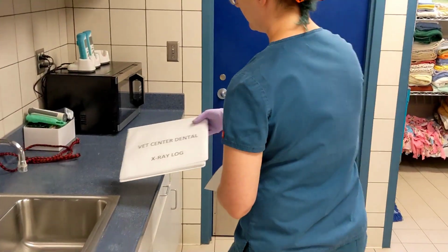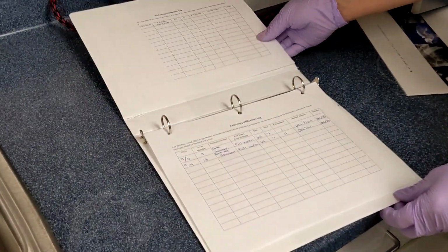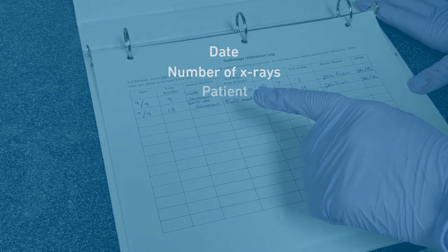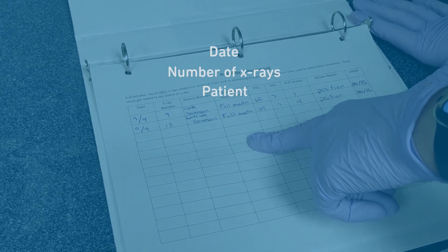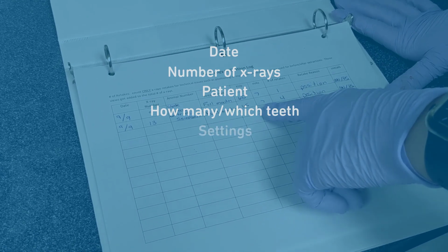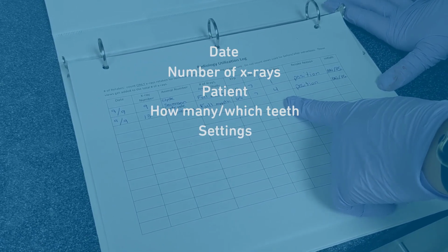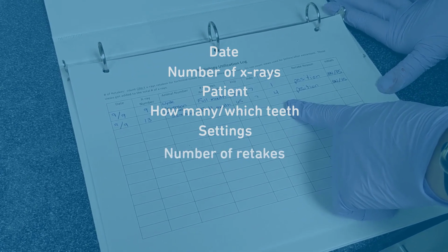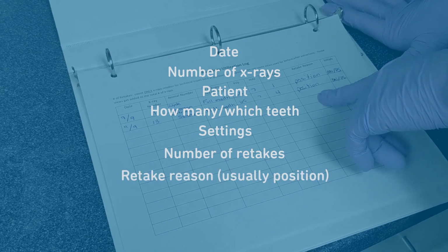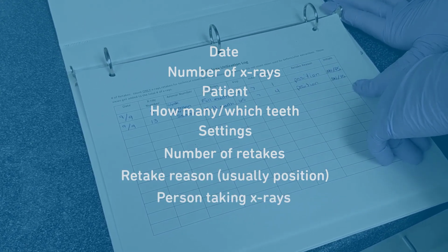And then you put it in here at the end of the day. So you've got this dental log, and you track the date, the number of x-rays you took, the patient, whether you just took a couple teeth and which teeth, or full mouth. And then the settings, like I said, always stay the same, but you might need to write, okay, we took however many retakes due to either, usually it's not exposure because I said these don't change, and it's almost always position. And then who was doing the x-rays that day.